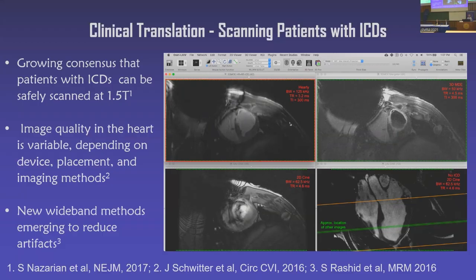And so particularly that the VT substrate is exactly the same. We think we've got a great animal model, but it's not perfect. Anyway, so we've got to go in and do patient studies to see if this works in patients.